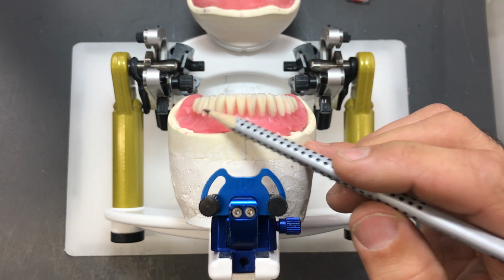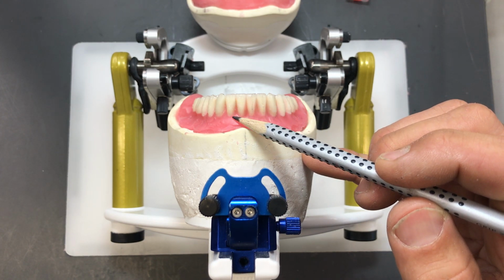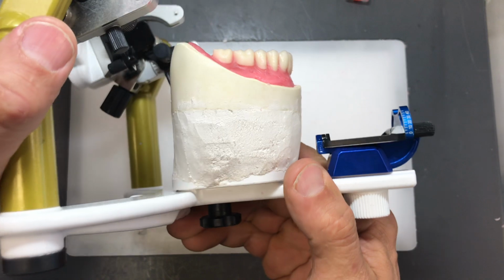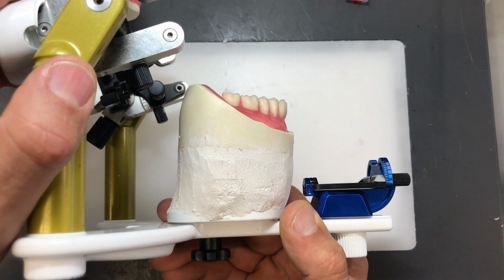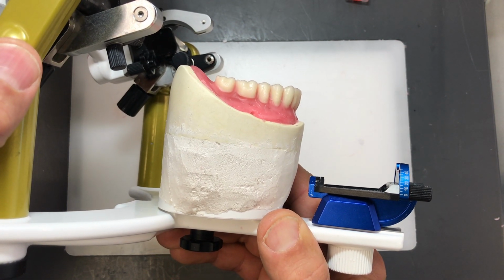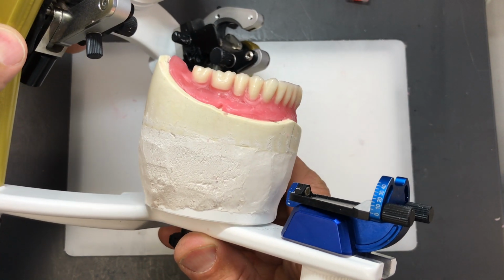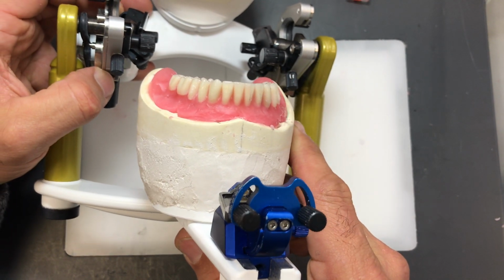So we have the buccal slope, lingual inclination, no lingual or labial inclination. So the laterals, when we look at them from a proximal view, are pretty much straight up and down. And then the centrals have this slight labial inclination, so the incisal edge is outside the cervical third of the tooth, and so forth. And there's a gentle transition all the way to the other side of the buccal slope.